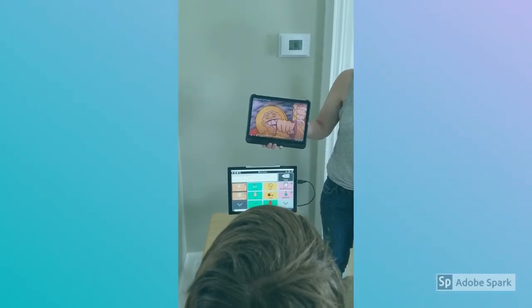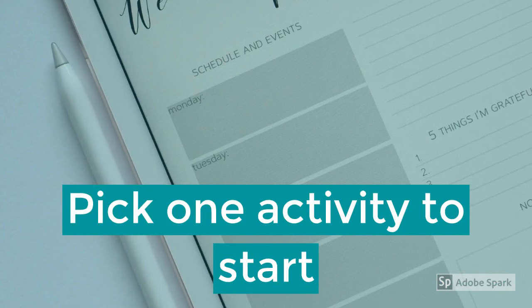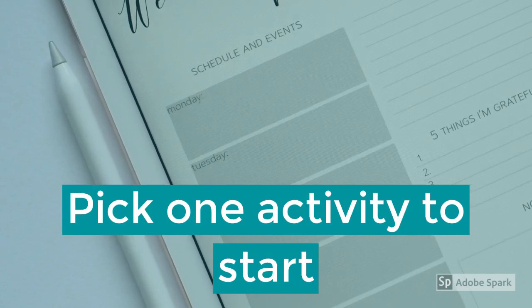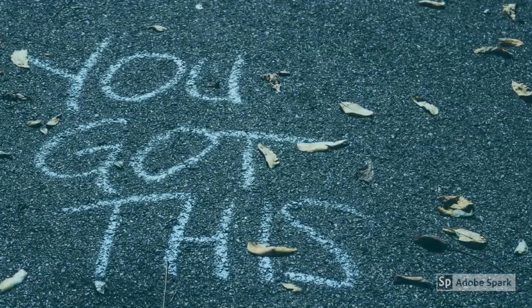Remember to keep it simple. Pick one activity or part of your daily routine to start with and build from there. You've got this.